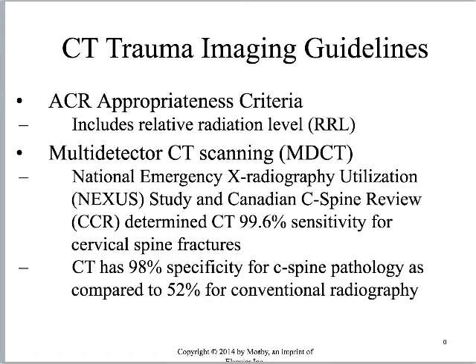The same is true as we're working with the patient. They're going to ask us, will you please take off the collar? This thing's choking me, all of those types of things. Please make sure that they understand that they need to hold still. It is never, ever, ever at your discretion that you can remove a C-spine collar, right? Even if the person has like a locket or something that's obscuring your images, it is better just to leave it in place, do the imaging that you can, do not remove the collar. That would be an awful way to injure someone and to lose your job.